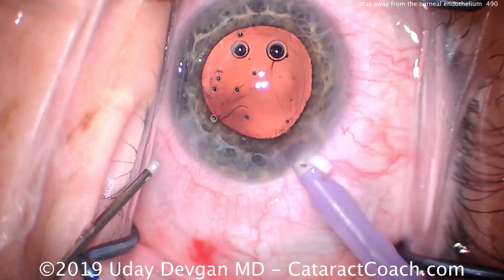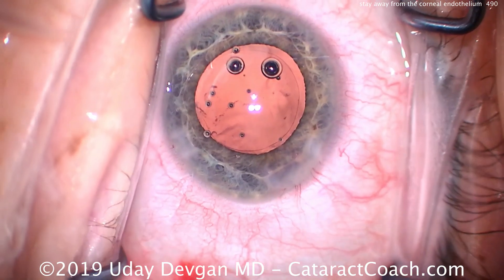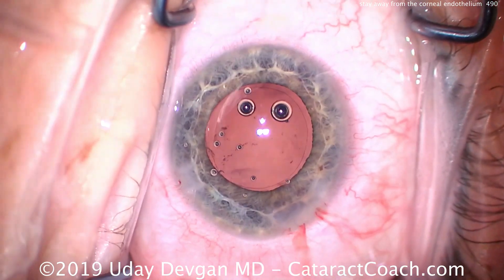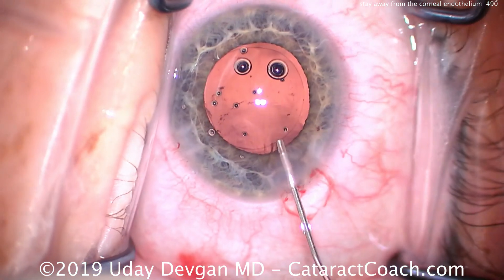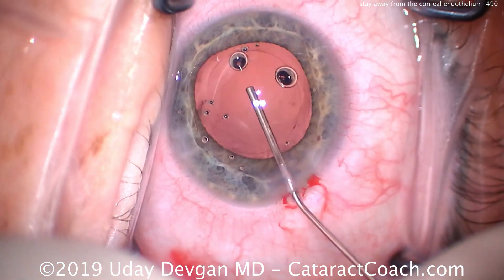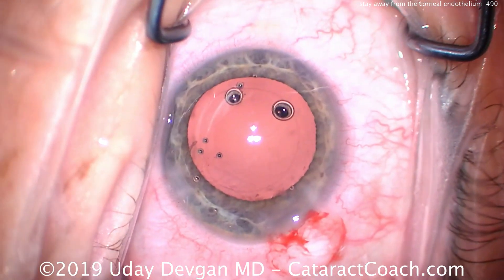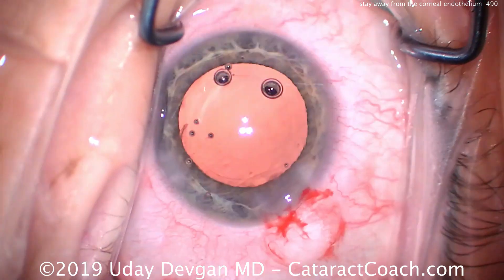You still see those same air bubbles. We'll remove the instrument, but we have another method: we can inject our cohesive viscoelastic now when we fill the capsule bag, and we'll push those bubbles away from the central corneal endothelium so they get out of the visual axis.